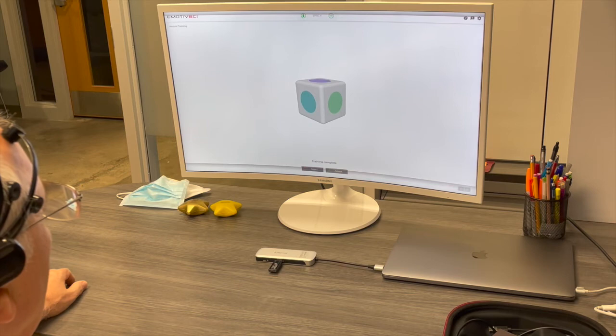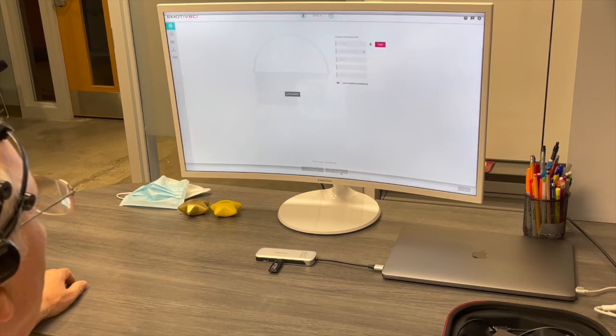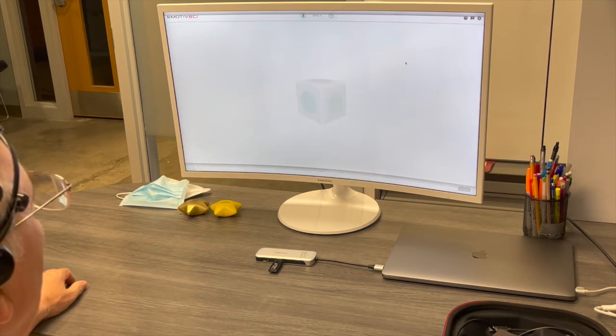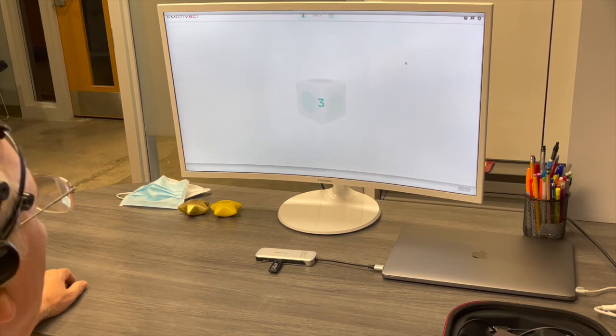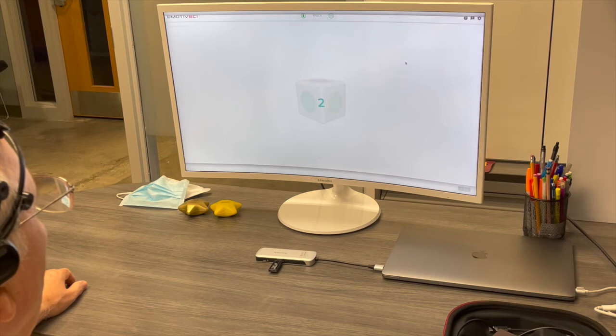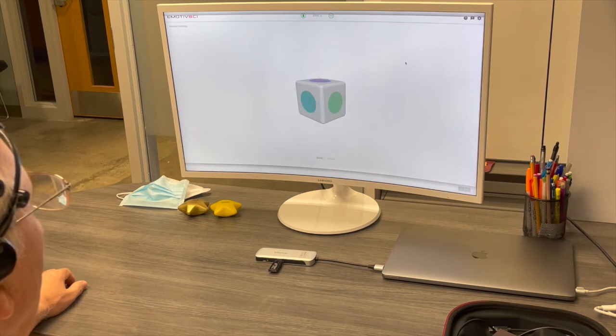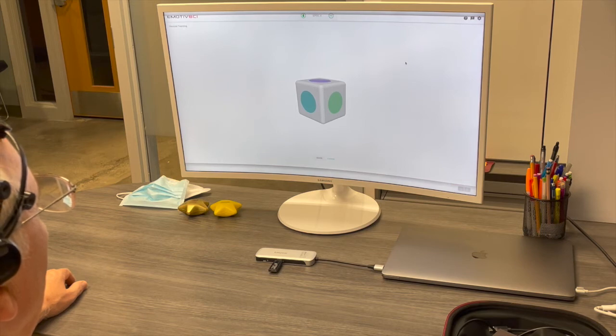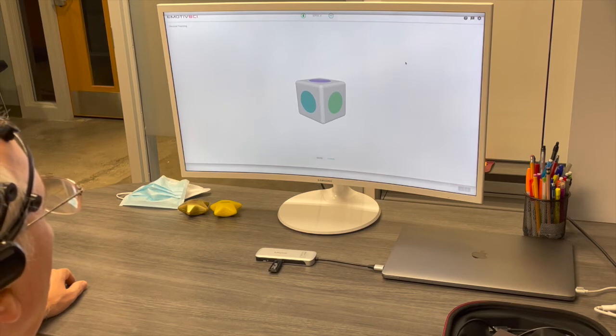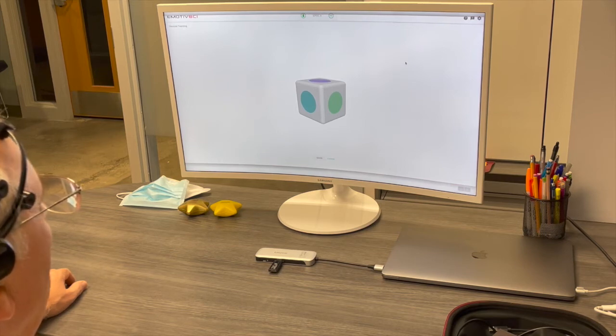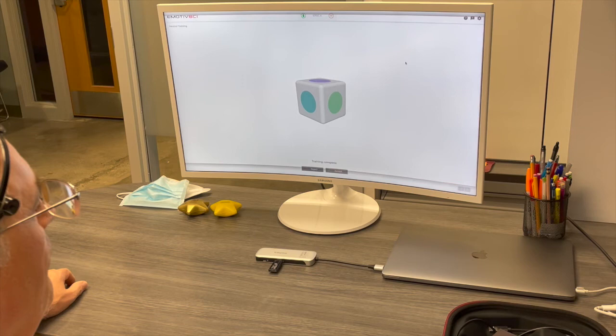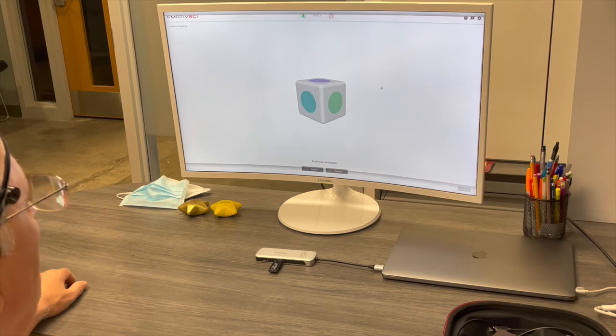This is, again, the relaxed position. And as I recommended, you should train the neural network multiple times. This is an eight-second relaxed position. So that kind of takes the baseline of your brain activity.